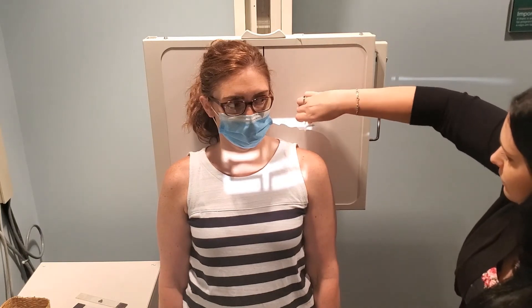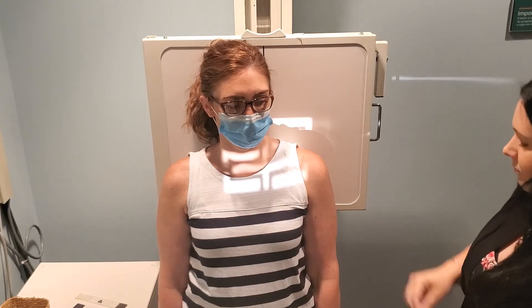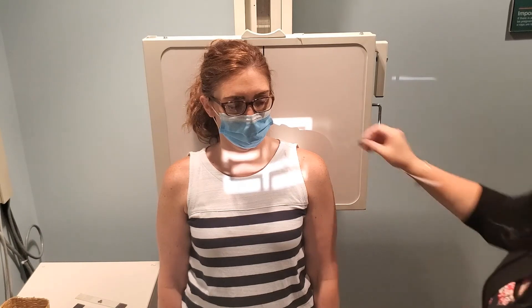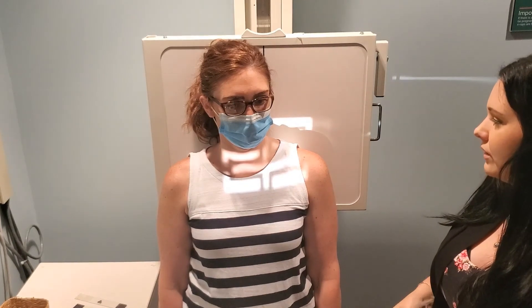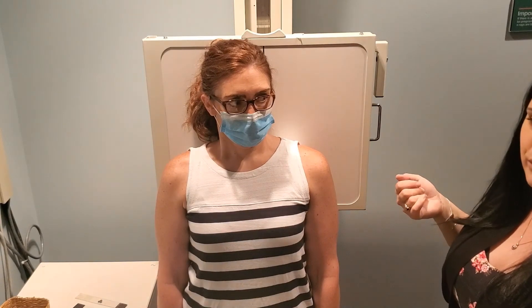Move your marker so it's back within the light field, then throw it back up in that light field — that's all you need to do for the axial. Make sure you know the breathing instructions: this is full inspiration. Have the patient take a deep breath, hold it, and then walk back to make the exposure.